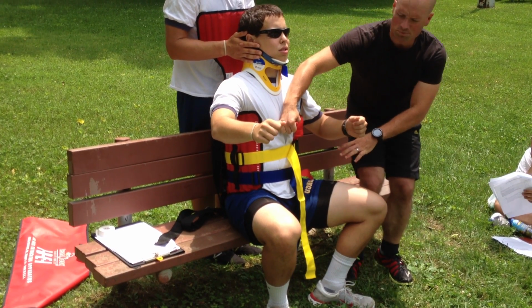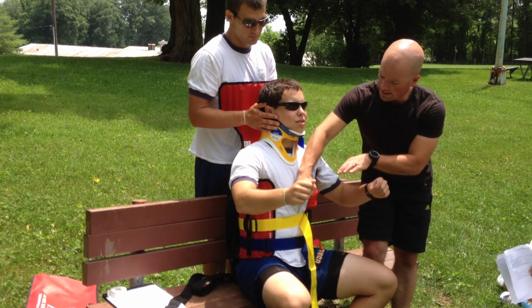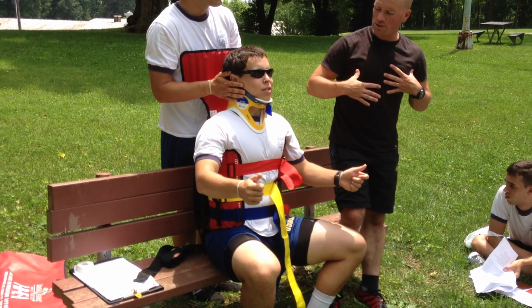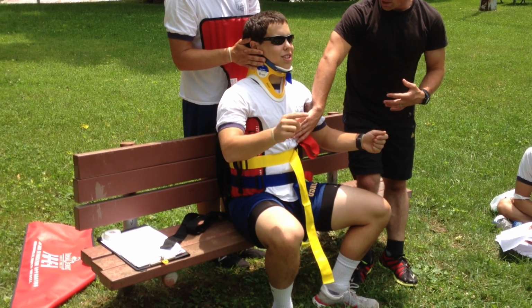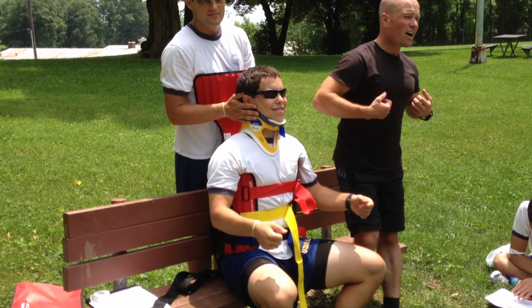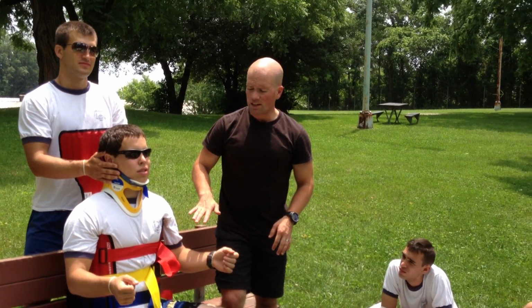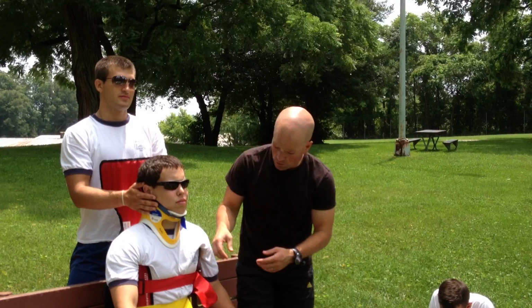And I like to hold this in place by tightening the bottom and the middle straps the most. And I leave the top one a little less tight, just because that's the one that's going to really inhibit the breathing. You can feel it's challenging you to breathe a little bit, right? Can you still take a deep breath? Okay. He looks like he's zen. If I was to tighten that red one quite firmly, which I might do right before the move, I don't need it right now while I'm still positioning the device. I want the patient to be able to breathe comfortably.